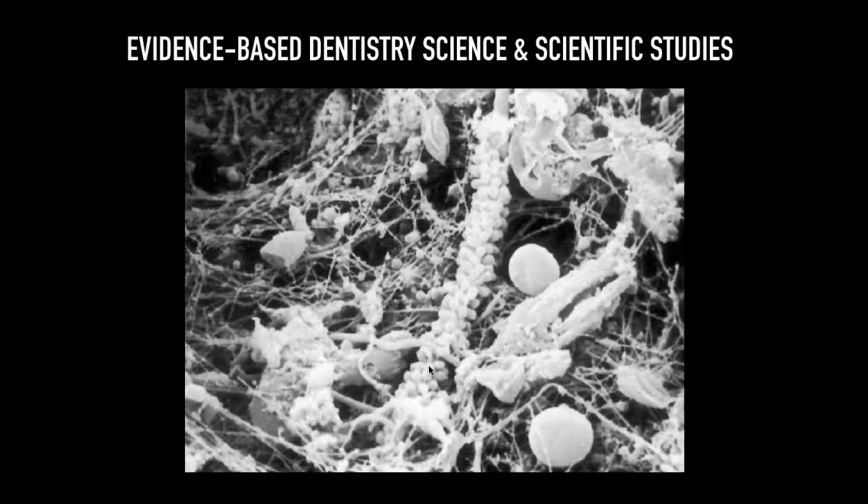Now, bacteria are the main enemy of the root canal. And of course, the objective of endodontics is to either prevent and/or eliminate apical periodontitis. In vital teeth, of course, we're not dealing with bacteria, so we want to prevent the ingress of them. And when we deal with an infected state, we want to make sure that we get rid of any bacteria that are within that root canal system, and any that remain, such as in the dentinal tubules, we want to entomb them within the tubules so they don't come back out into the root canal space and then the periradicular area. So one of the landmark studies is Kakehashi, Stanley and Fitzgerald, which used germ-free rats, and they exposed their dental pulps.